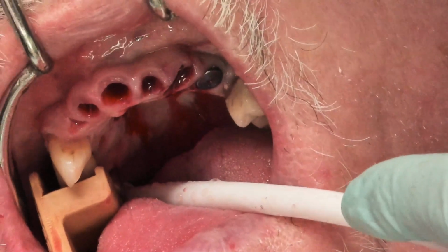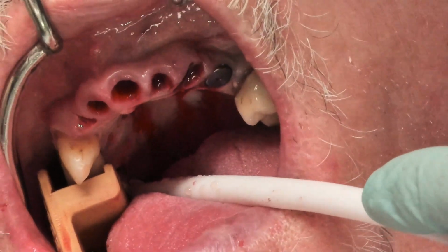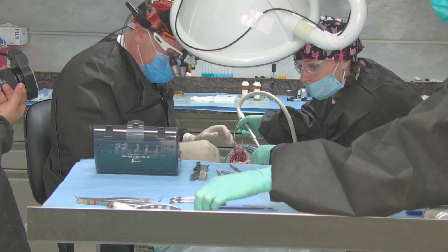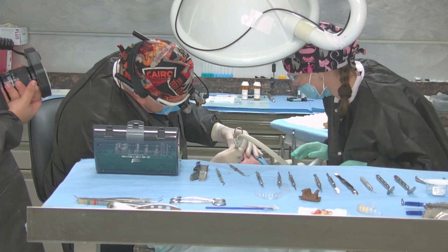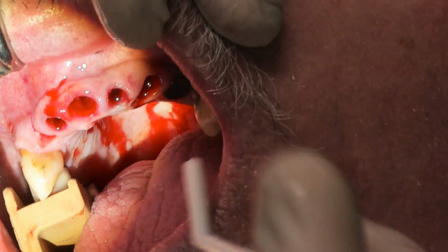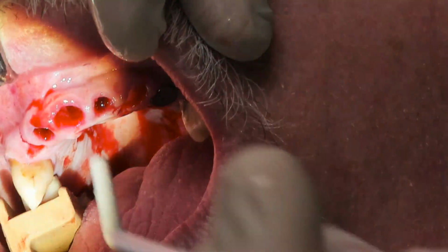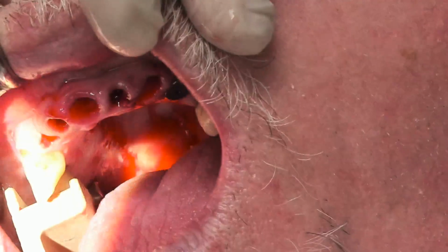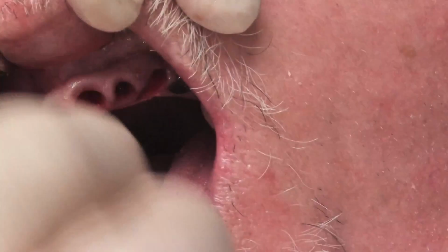Doing okay, y'all? Yeah. Good. All right, so that's going to open up the site where I don't have the extraction socket. Okay, so we'll have to show. Now, can I have the suction tip for a second? So let me inspect the site. So now I'm just inspecting my sites.